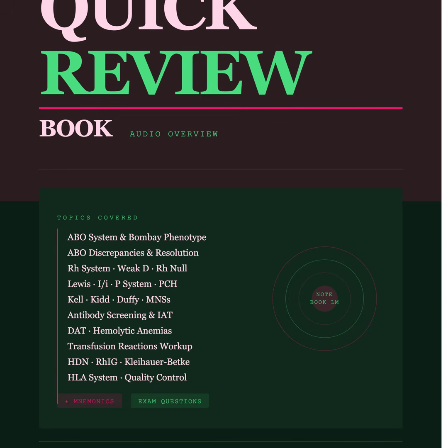This brings up a massive point for the exam regarding clinical protocols. I know for a fact that hospitals do not perform a 37-degree AHG weak D test on every single patient who types as Rh negative. It would take way too much time. Way too much time. So who actually requires this extended testing? Testing for weak D is strictly required for two specific populations: blood donors and obstetrics patients.